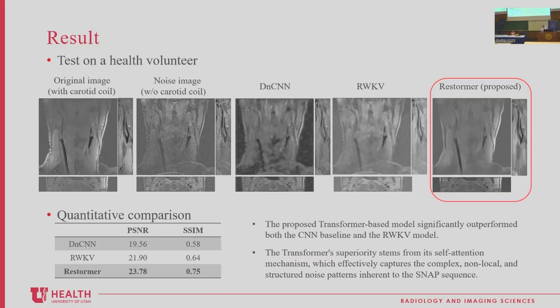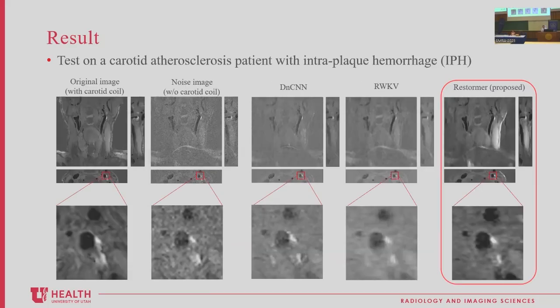What you basically see is that among these different approaches, this so-called Restormer seems to be performing the best, at least by looking at the images and comparing them. And there are some real numbers to back this up. In addition, one of the subjects shown here is a sample of images from a real patient.